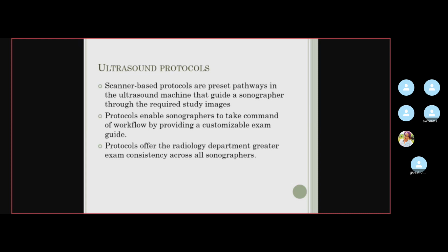What is a protocol? I've told you that they are presets which are fed into the ultrasound machine by the manufacturers. The use of these protocols is that it makes it easier for the sonographer to select the settings without wasting time. Once the protocol is set, we have to select the transducer also.